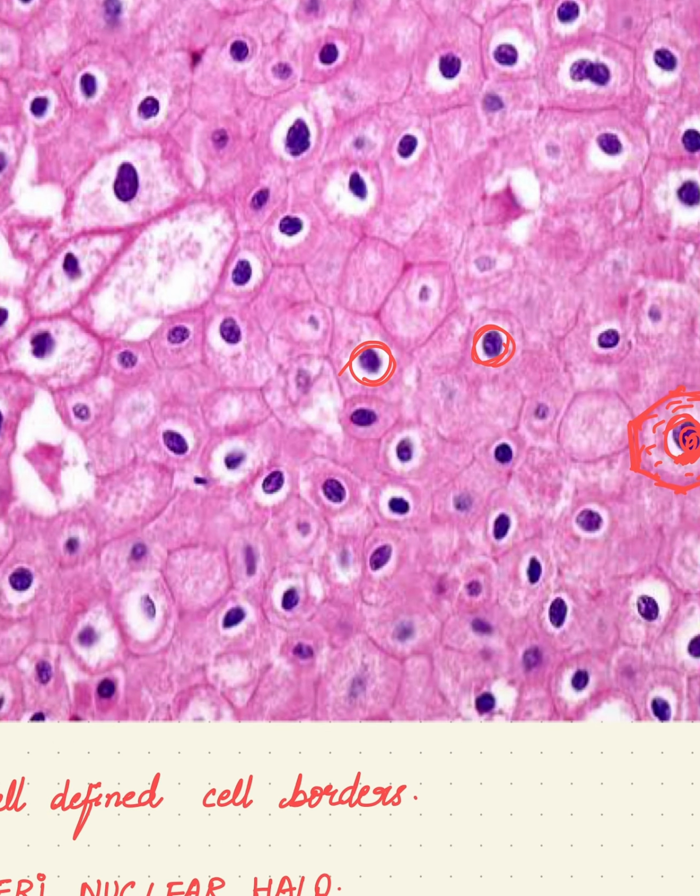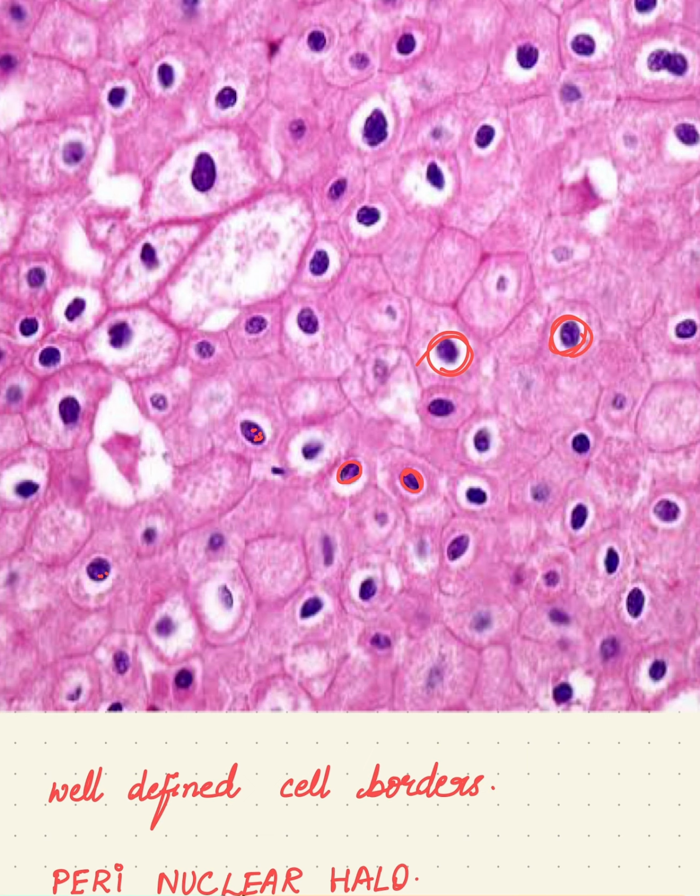And the nucleus here is hyperchromatic, and it looks shriveled. Here and there it looks shriveled. The staining pattern is very dark, and the adjacent area is light. This is a shriveled pattern.